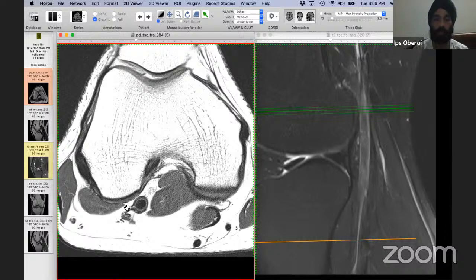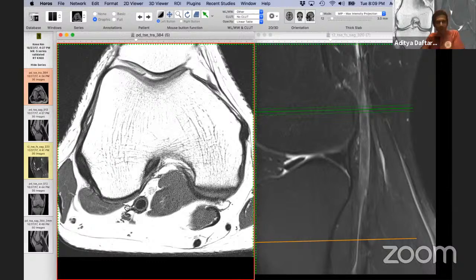Personally, I don't see any massive change in anything we're doing by using 3D cube. The biggest importance of that would be that if we can get patients scanned faster and still have the same resolution, then that would obviously be fabulous.